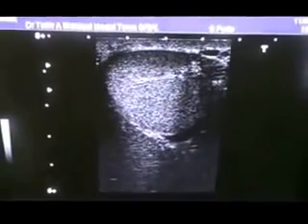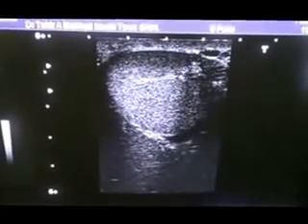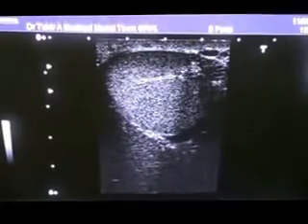This is the transverse section. In one of the previous videos, I had in fact reported the mediastinum testis incorrectly. Now I will show you how mediastinum testis appears — as this echogenic tubular structure with a lumen. This is the mediastinum testis.